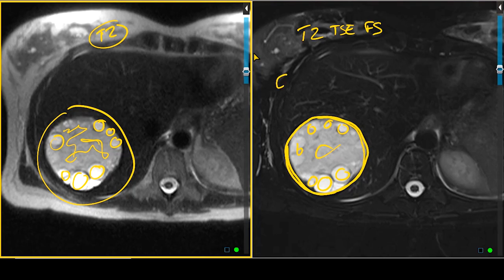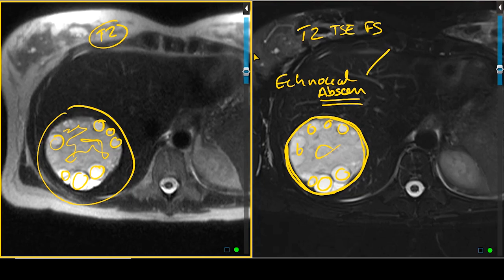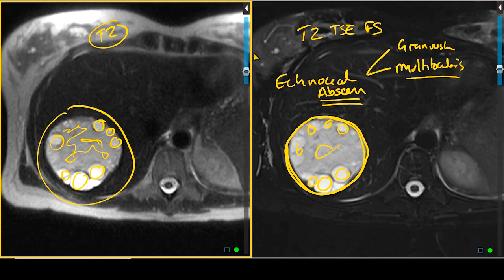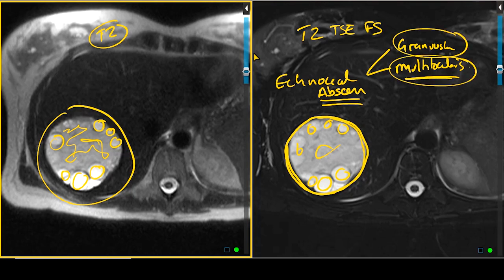This is known as an echinococcal abscess, and this is a manifestation of hepatic hydatid disease. This results from infection by certain tapeworms — Echinococcus granulosus, which is the most common, and Echinococcus multilocularis, which is less common. The multilocularis tends to be more aggressive in its appearance, while granulosus has the imaging appearance that is quite characteristic of what we are seeing here.